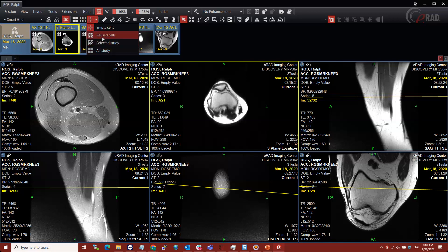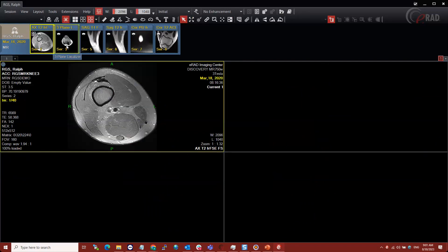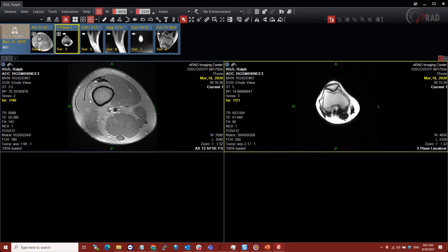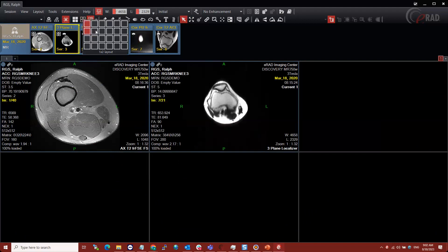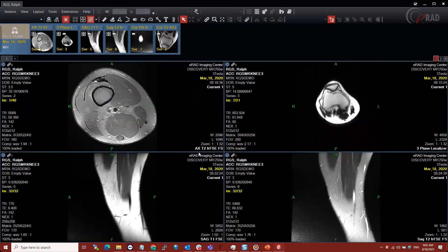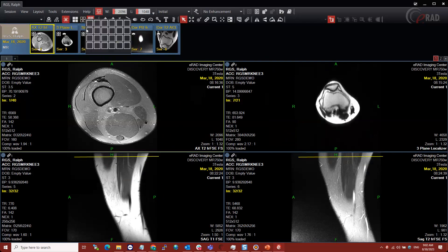They all do basically what they say. Empty cells means if I pick a layout from the dropdown — say I change this to 4 on 1 — it empties it out. Reuse cells means if I have content in the frames already and I change my layout, it keeps whatever is already there. Selected study fills in whichever study is selected. And all studies would do the same for all studies. Right now since I have no prior, all studies is basically the same as selected study.